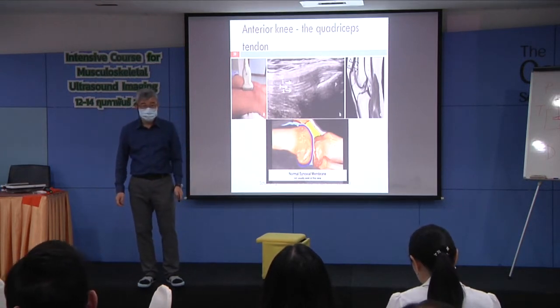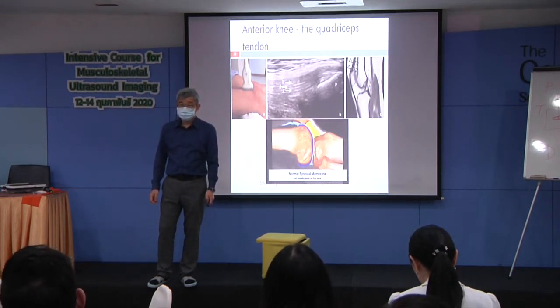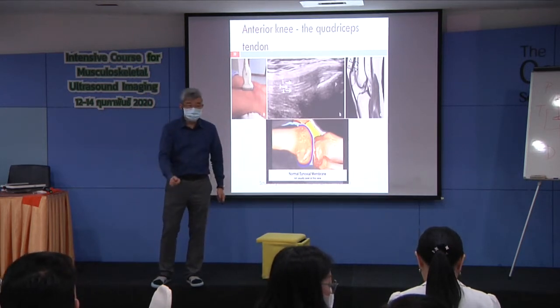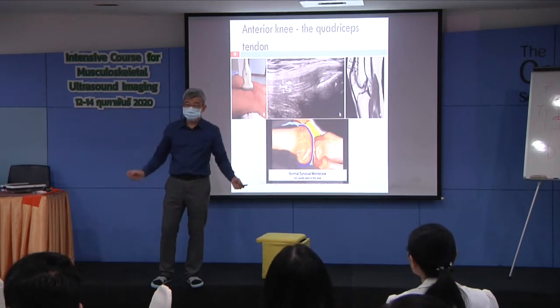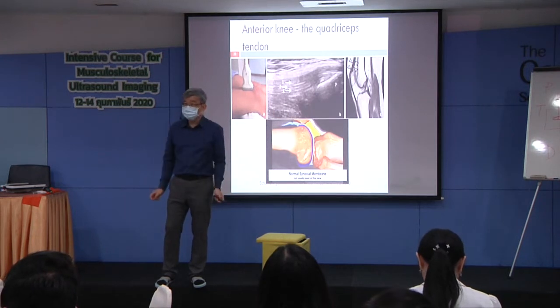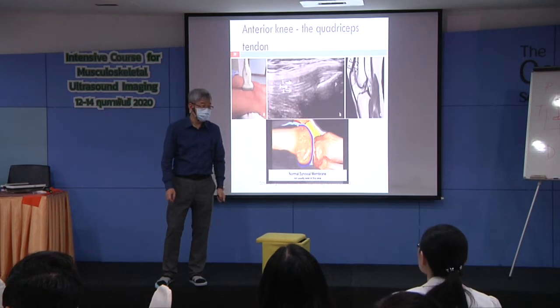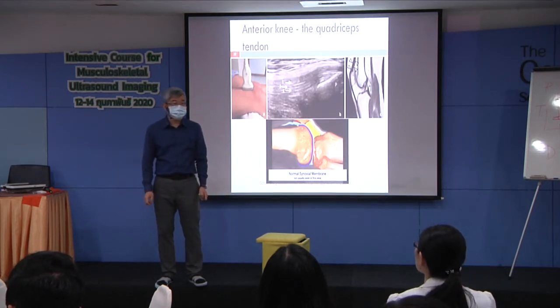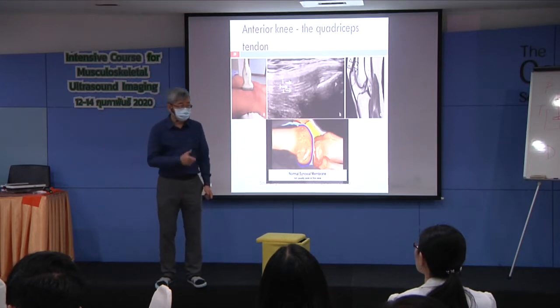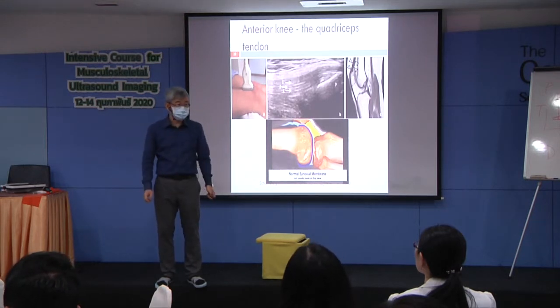The question depends on what tissue you are looking for. You say, no, I want one device that can see everything. Okay, one device to see everything depends on all the skills you need. Basically, there are 4 or 5 basic skills, but I consider 7 basic skills, and you all learned the 7.